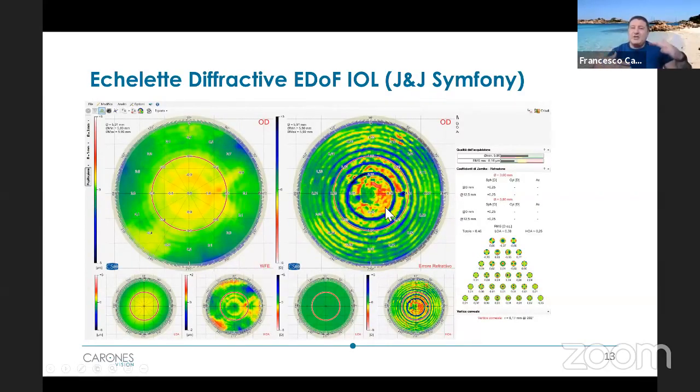But the continuous change in the length of the focal point gives the final outcome. Each single step actually spreads the light, let's say elongating it from hyperopic to myopic, to demonstrate the elongation of the focal point.